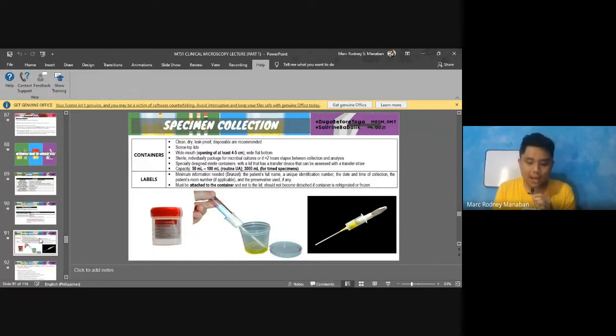All right. Now again, it should be sterile. Again, if na culture, but it's actually recommended that if the urine is greater than 2 hours to be processed, or dili siya ma-process within 2 hours, it's best to use the sterile containers because again to prevent external contamination na. All right. But if it can be processed within 2 hours, pwede na itong mga disposable na dili sterile.